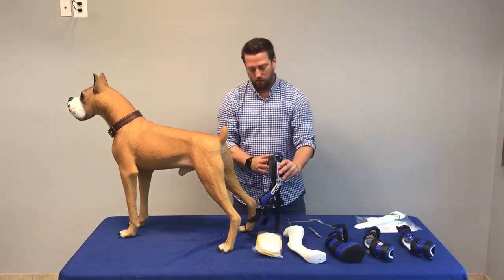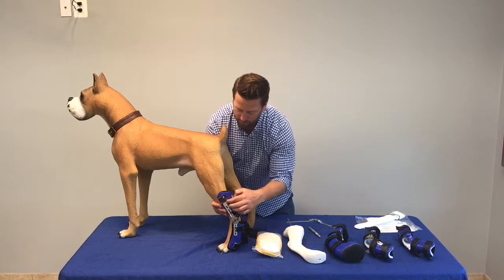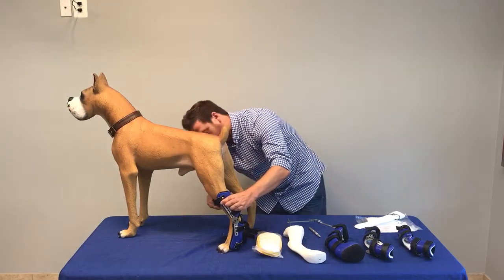The brace fits on the back of the dog's leg. Just for reference, the D-rings are usually on the lateral side of the leg, and I'm just going to start from the top and go down. Again, the sequence isn't important for a tarsal brace.